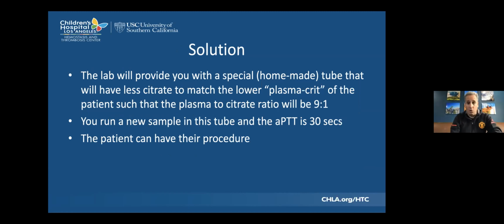Well, what's the solution? I mean, Dr. Young, I can't fix the patient's hematocrit. What can I do? Well, you can talk to your lab. The lab can provide you with a special, essentially a homemade tube. They'll just grab a regular plastic tube, and they will look up the CBC. They'll look up the "plasmacrit," if you will, right? So the opposite of hematocrit. Plasmacrit's not a real word, by the way, so don't use that. That's why it's in the quotations.